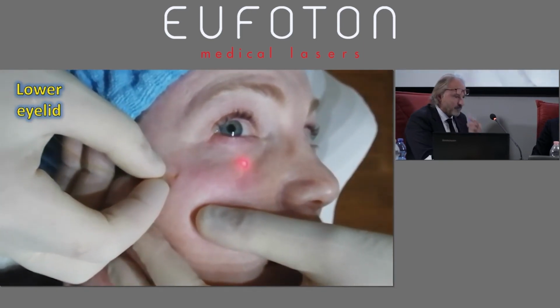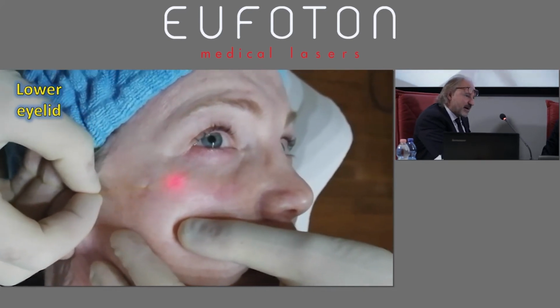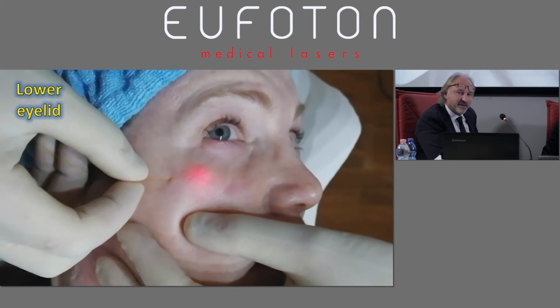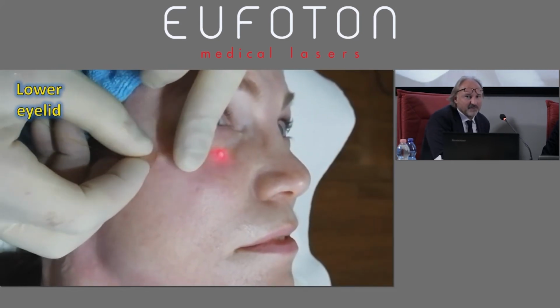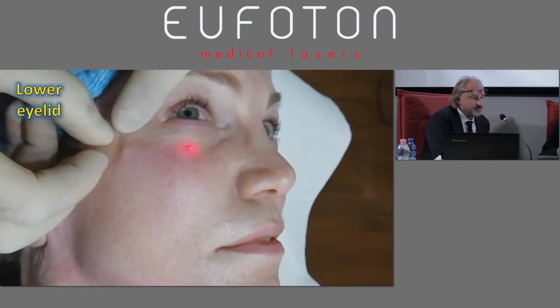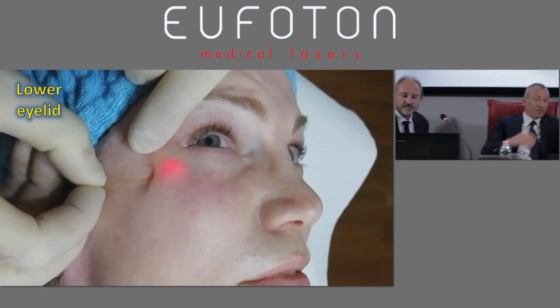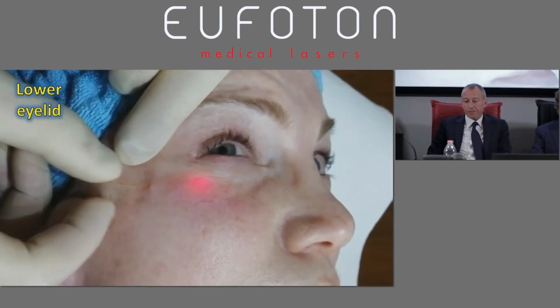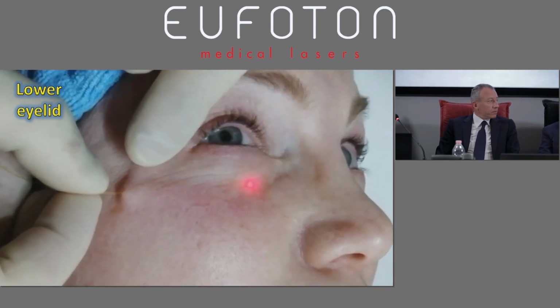So if my followers ask me something about the Endolift for the periocular area, you have to say there's rejuvenation of the periocular area, reducing skin sagging, but not the bag itself. Just pushing the bag backwards. Pushing the bag backwards. Yes, good. I got you. One question.